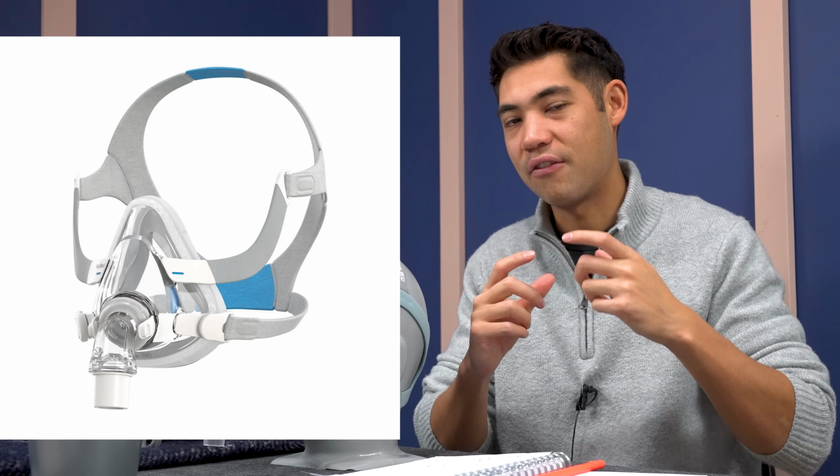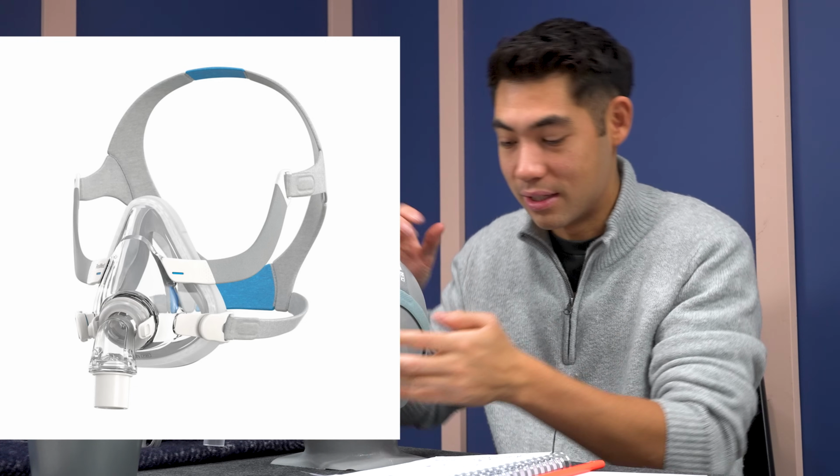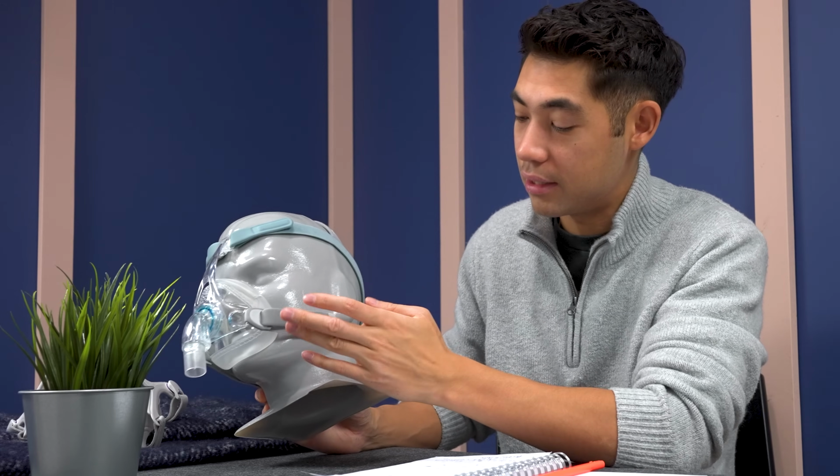Okay, so if you're looking for a mask kind of this style, you might also be looking at the ResMed F20 mask, which is also a great mask. However, the reason why I'm picking this one over that one for a side sleeper mask is the ResMed F20 kind of goes along the cheek and up here. You can see it kind of goes in this area here, whereas the Vitera goes below, kind of around that jaw area, and then above, way above your eye.